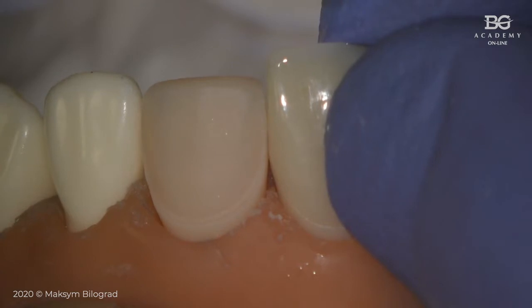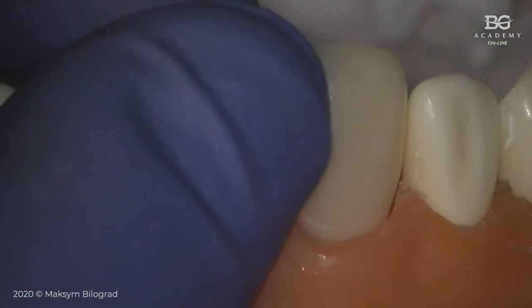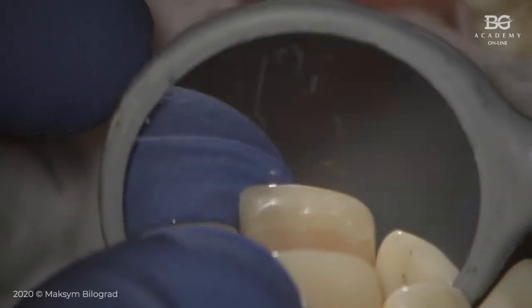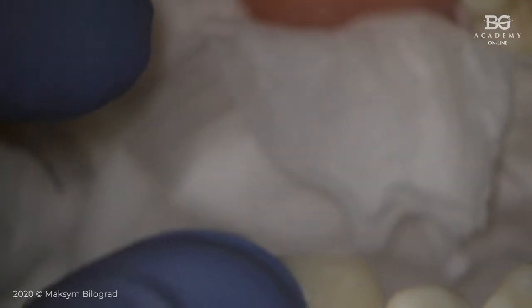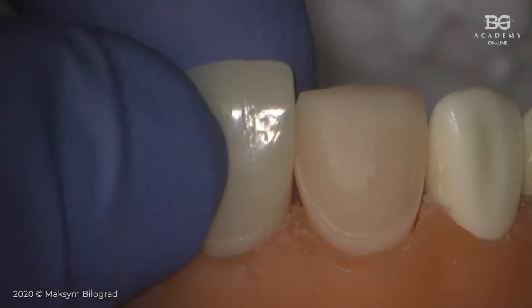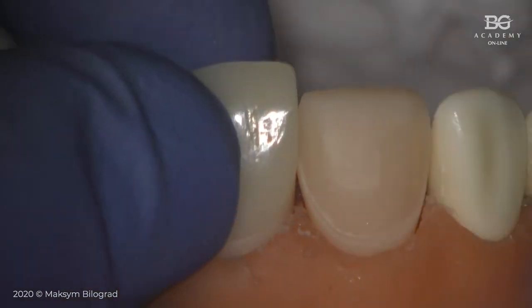We would like to see if fit is okay, if fit is good, fit to the finish lines, and also from the palatal side we have to see the same good fit. If everything is good, if you are happy with fit, then you can take another veneer, okay, and do the same, just to control if fit of this veneer is okay. The fit to the finish line from palatal side as well.